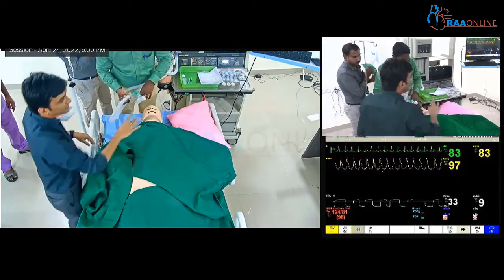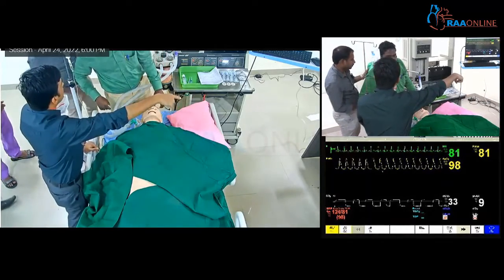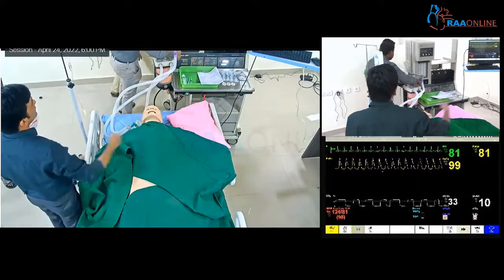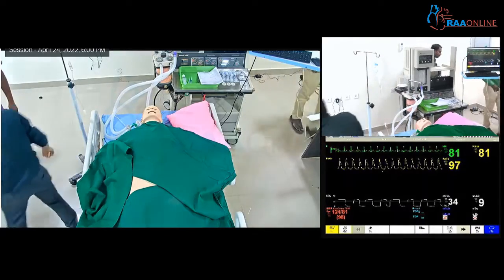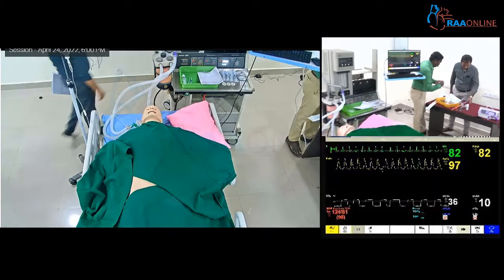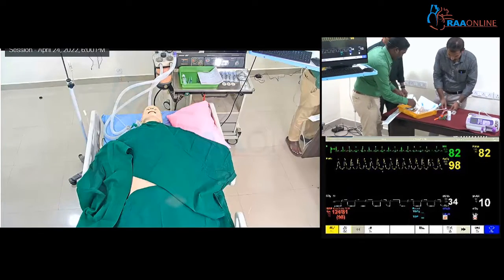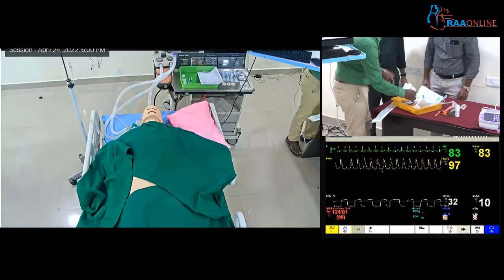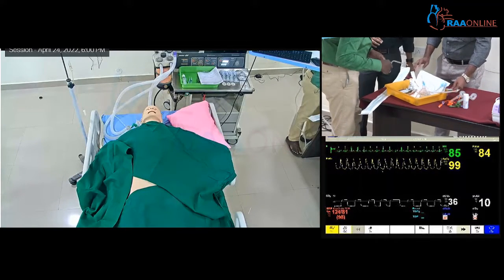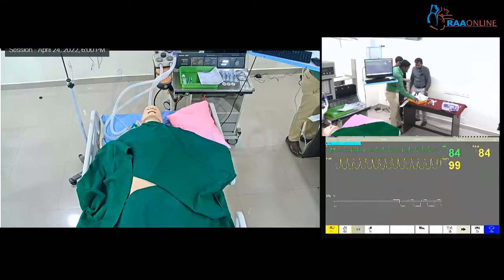Good. And then you have an airway trolley here. You want to have a look at what is there in the airway trolley? Something very similar to what we normally have. Usually these are the things which are normally available in the OT. Airways are available. Nasopharyngeal is there. Laryngoscope, endotracheal tube.